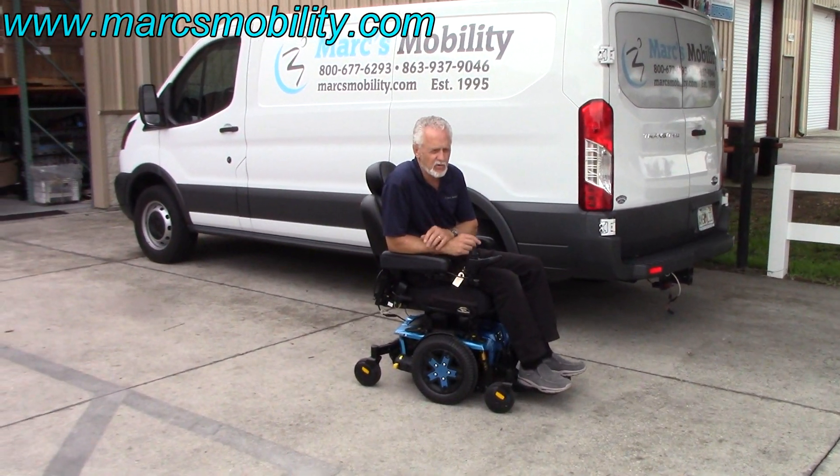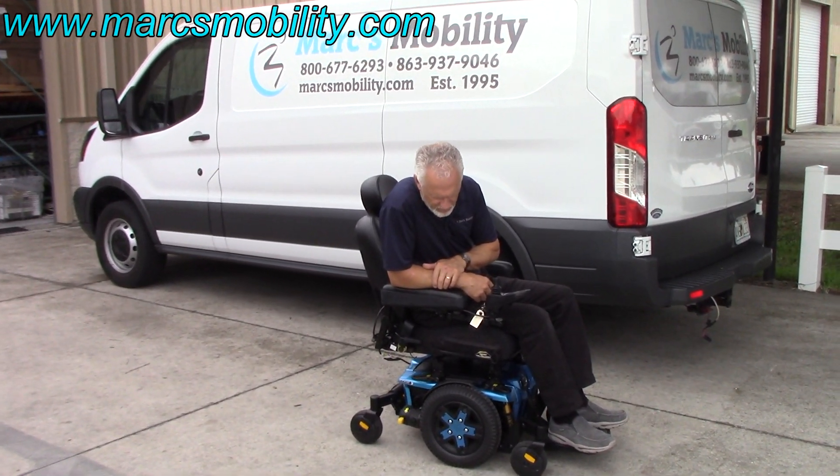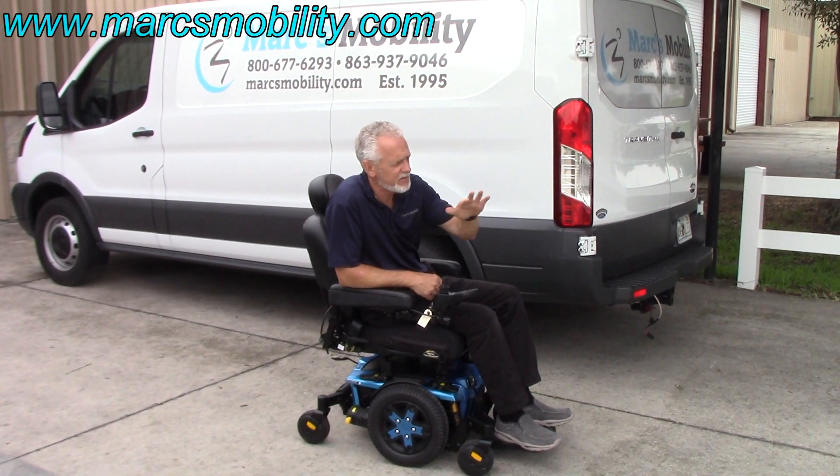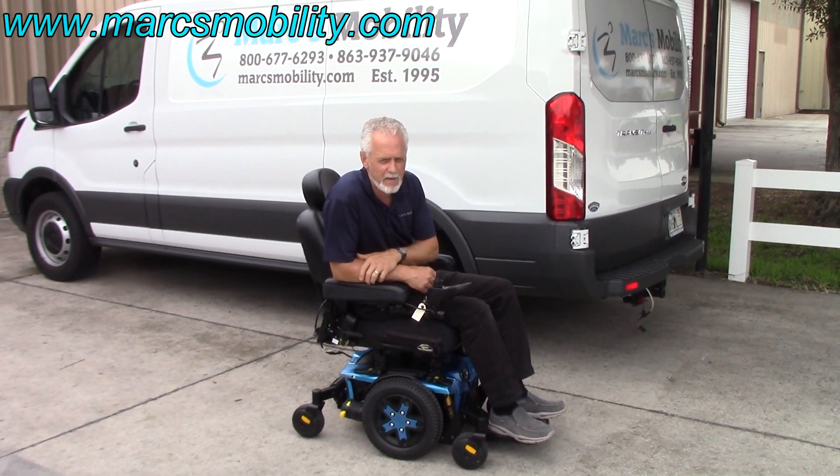This is the Quantum Edge 3, the newest power chair they came out with this year. The suspension is unbelievable — when I went through the grass it barely bumped. The suspension is even better than the ones before.